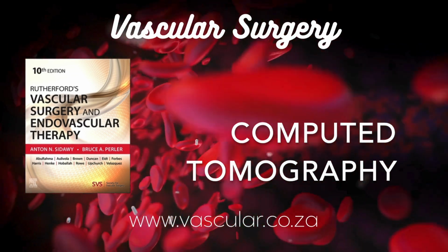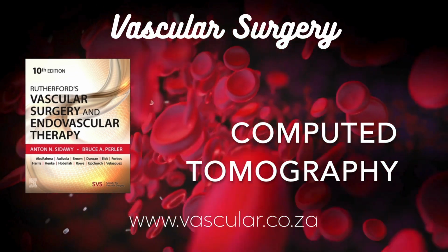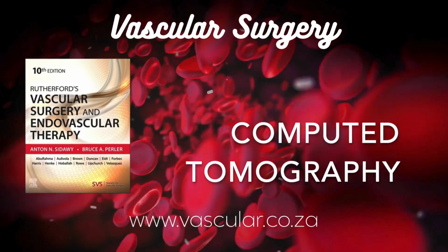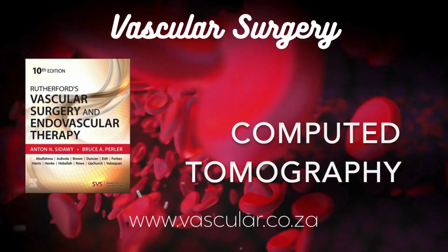Right. Which diameter do you pick? Exactly. Spiral CT with MPR helps hugely because you can reformat the image so it is perpendicular to the vessel at the point you want to measure. That gives you a true circular or near circular cross-section for a much more accurate diameter. Okay, perpendicular views are key.